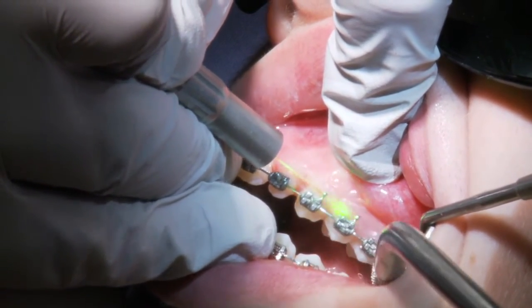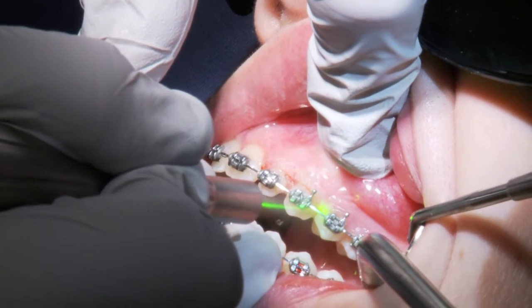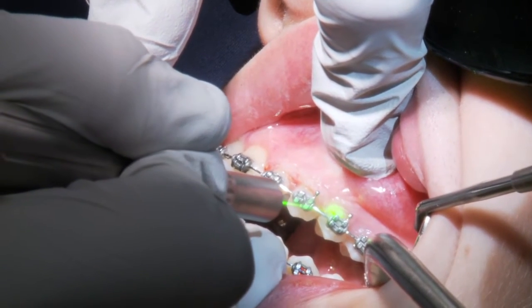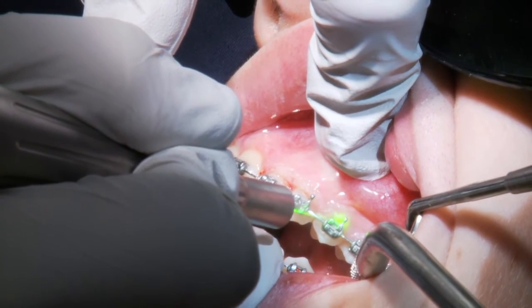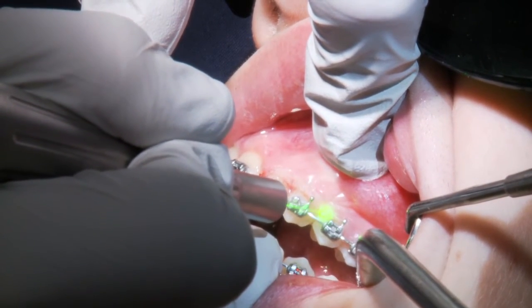We finished in about an hour, maybe an hour and ten minutes. We were able to sculpt the tissue with the laser and bevel it all the way through. Overall we have a satisfied patient and satisfied parents, and in five days I'll be satisfied with the result — hopefully her post-op experience is as good as I think it's going to be.